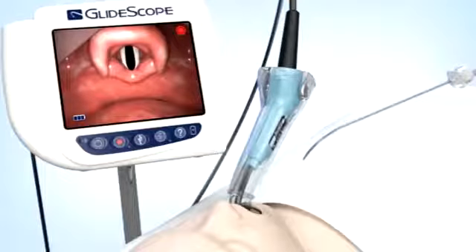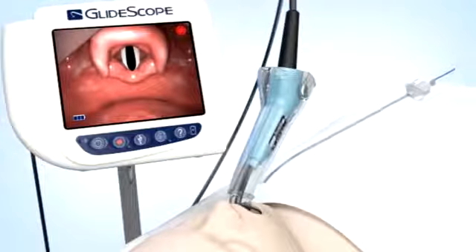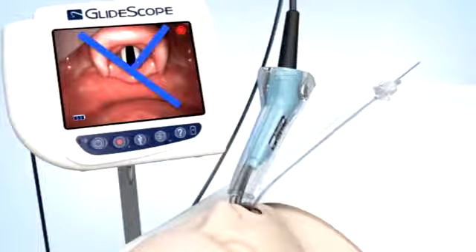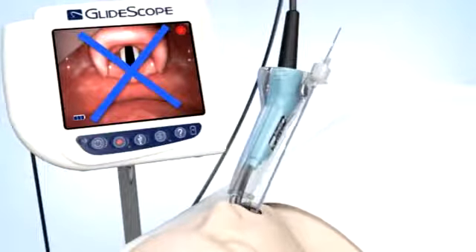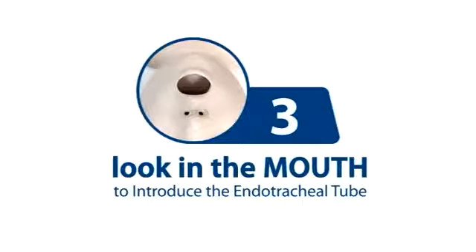At this point, the user may be tempted to immediately insert the endotracheal tube and try to navigate it through the glottic aperture while continuously looking at the video screen. However, in Step 3, it is very important that you look directly at the patient's open mouth, watching the passage of the endotracheal tube to help avoid potential injury to the tonsils or soft palate.